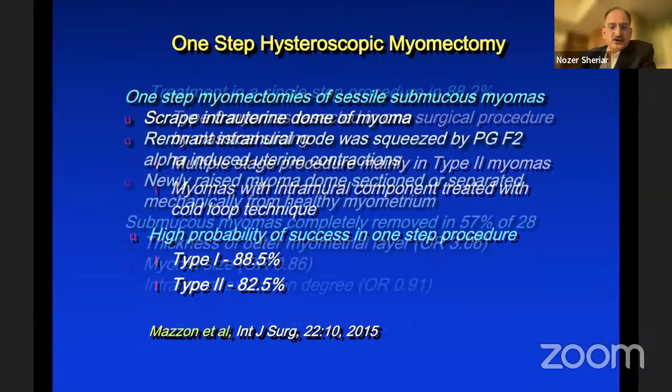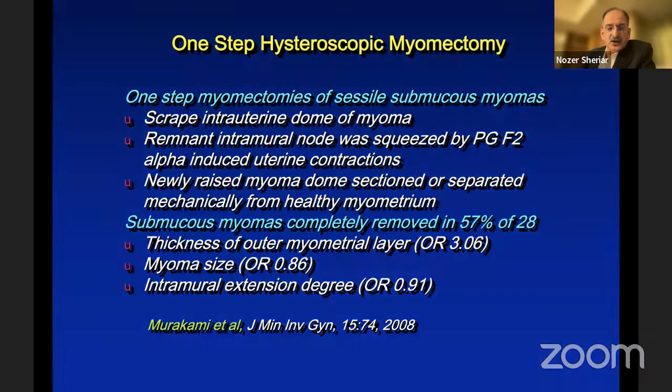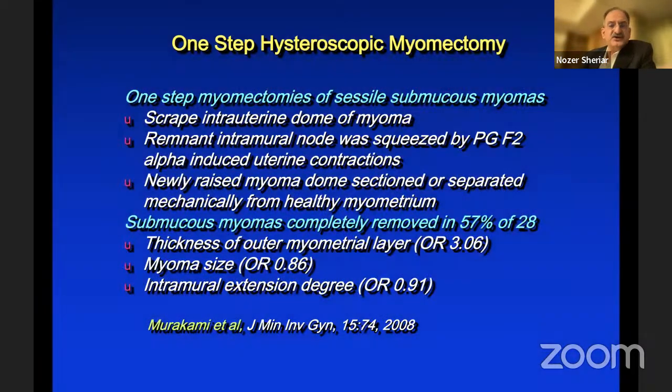If you can't finish it off in one procedure, big deal. Give her a GnRH analog and go back after 4 weeks. And trust me, the residual myoma will be waiting for you in the cavity. Haven't had to do one in years, but always be prepared for it.